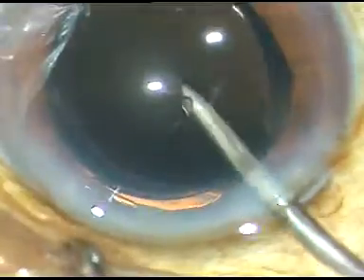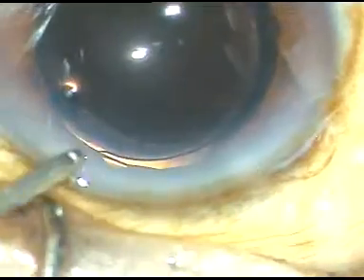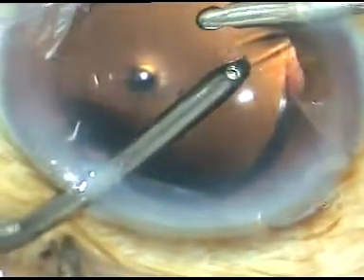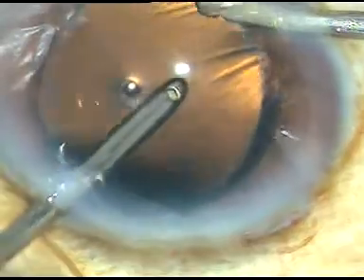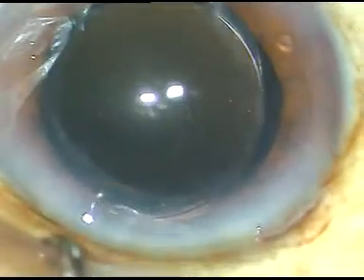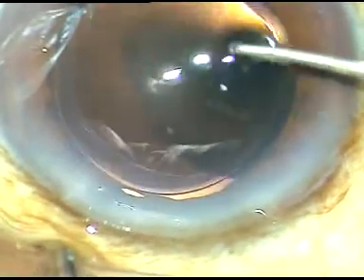And now irrigating probe and irrigation aspiration together I use to remove the rest of the viscoelastic substance. Thorough removal of viscoelastic substance is very much needed to prevent post-op rise of intraocular pressure.